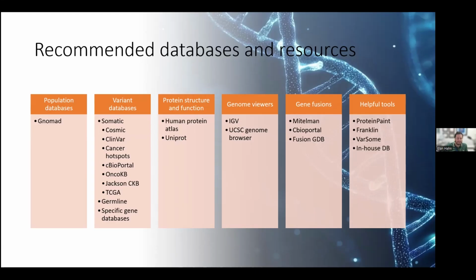And we also, when possible, want to verify the quality of the pathologic diagnosis provided, if they talk about the site or the histotype, or if there are images available.